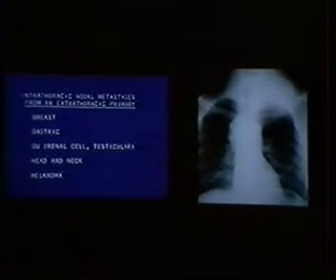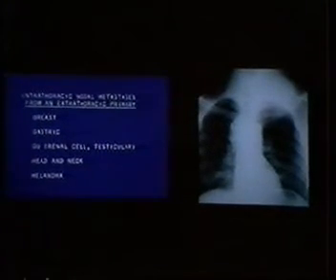So if you do a CT scan and you see attenuation numbers measuring 50 or 60, it doesn't mean you're not dealing with a bronchogenic cyst. Now, I mentioned that lymph node abnormalities are often seen in the middle mediastinum, and I think it's a good point to bring up what nodal metastases you want to consider when you see lymph nodes enlarged in the mediastinum.